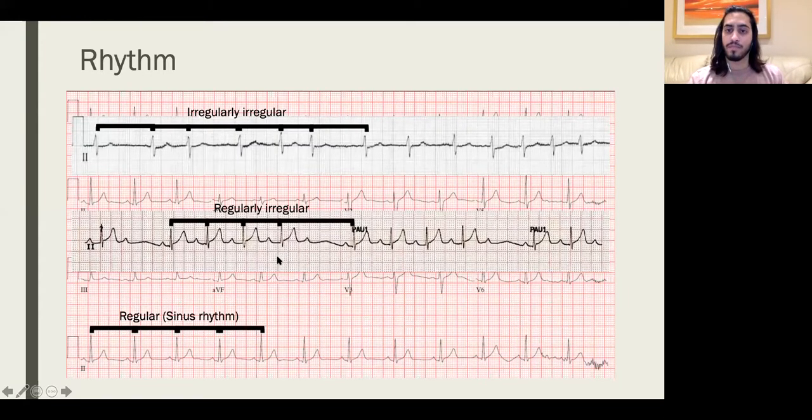This is heart block. What type? We'll talk about it in our next session, but just for those who are curious and the clinical students, this is second degree Mobitz type 1, okay? Because you see the P wave, PR segment, P wave, PR segment's getting a bit longer, bam, you lose a QRS. So this is regularly irregular, and we'll talk about the pathologies next time.